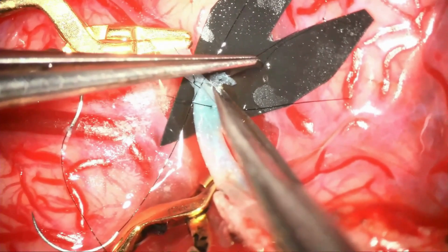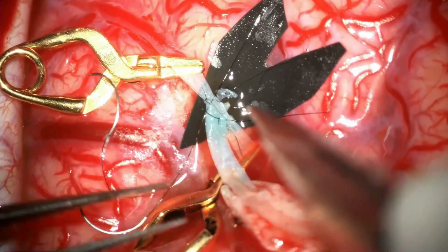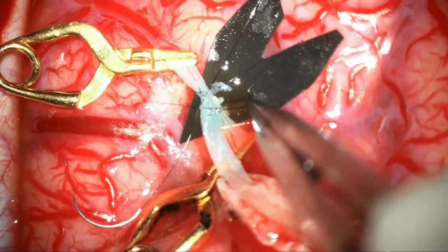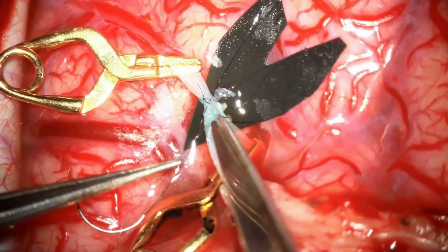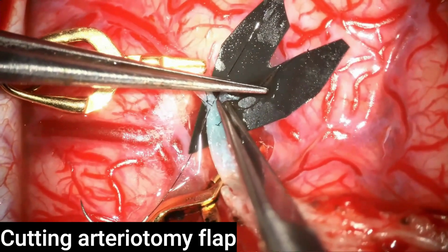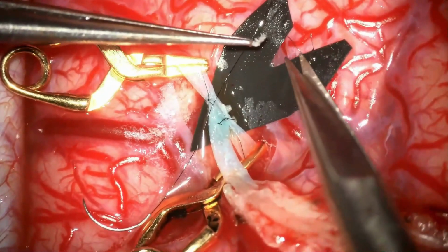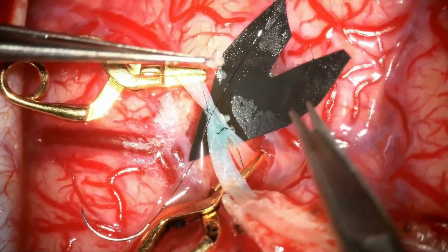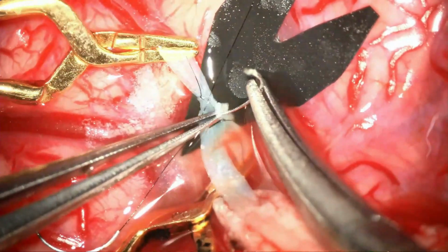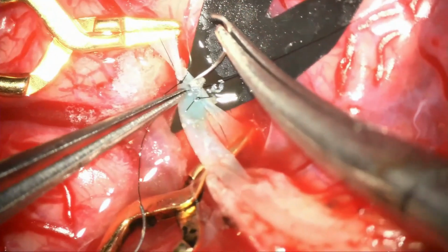The arteriotomy flap is cut partially to facilitate one knot. Then the flap is excised completely and sent for histopathology reporting for research purposes. Remaining stitches on this side are completed in intermittent fashion, keeping the sutures loose and tying knots later.